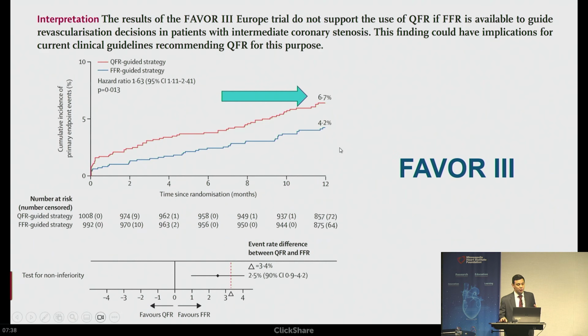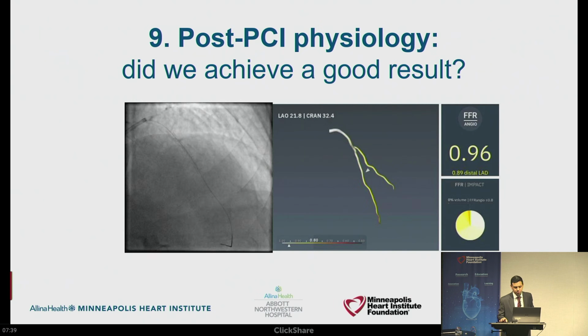A recent trial raised some questions about this. It's one with QFR, just published at TCT. This is one of the earlier technologies that came out. It uses 2 pictures, not 3 pictures as FFR angio, but this trial actually showed that the rate of adverse events was higher compared to FFR, which has created some degree of pause in the excitement for the technology. Therefore the trial that we were just part of, ALL-RISE, has taken incredibly more importance to understand what happens with these novel angiographic indices.